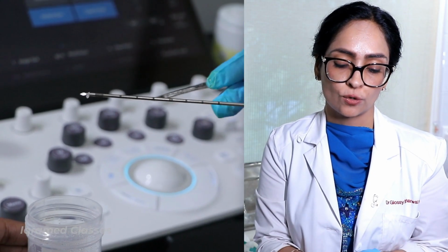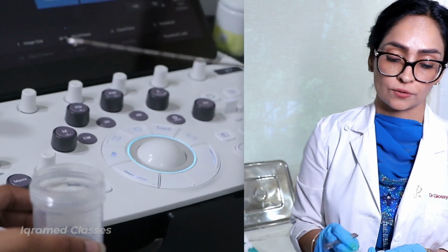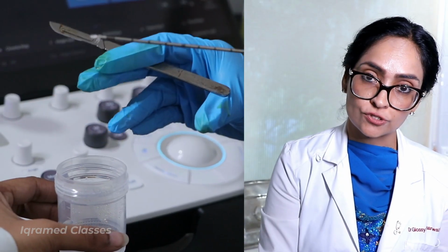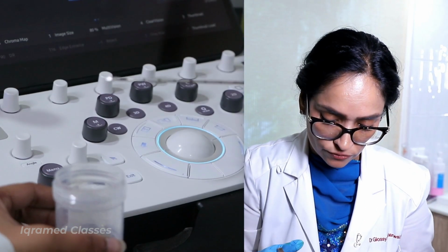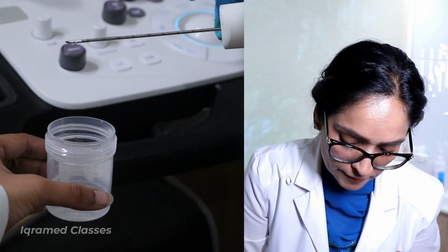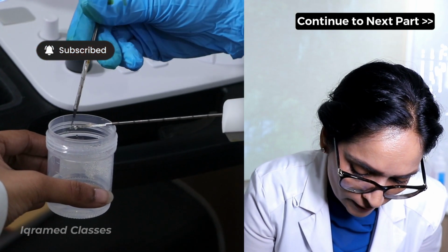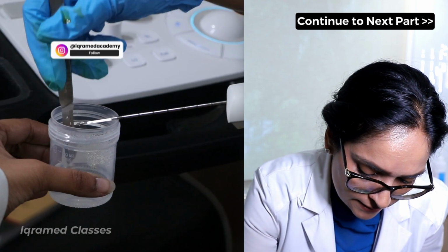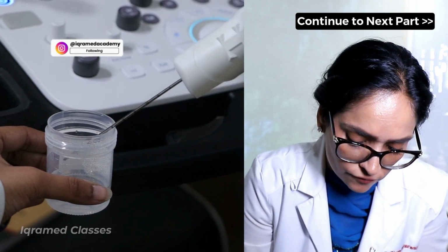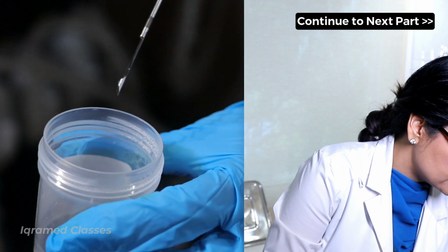Now, whenever you have taken the sample, you have to make sure that it is protected and completely conveyed to the pathology lab. How? Put the formalin solution container slightly lower than your level so that you can actually see that everything is going inside. Then you will open this. Now carefully look at this. This is the breast tissue. You will dip this breast tissue inside without damaging it further, and that's all. You can see that the breast tissue has gone in the formalin, and very nicely it can be assessed now.